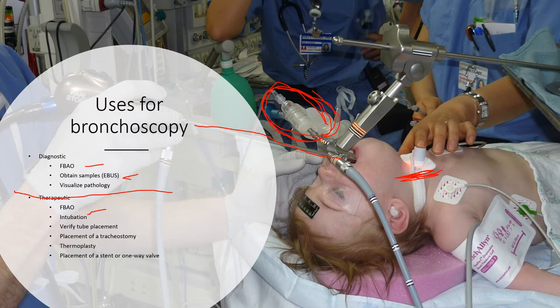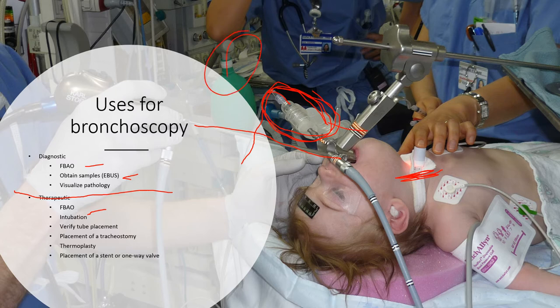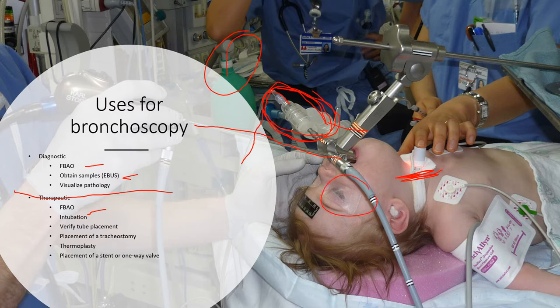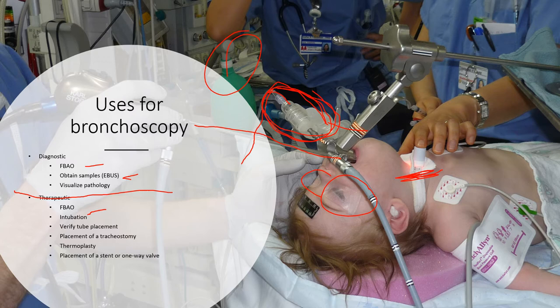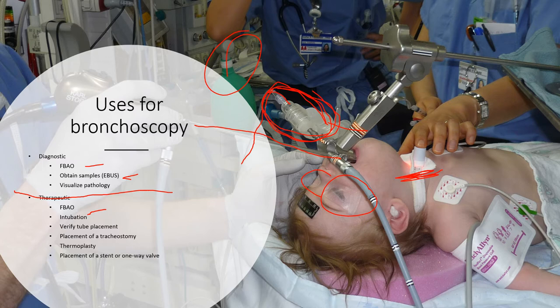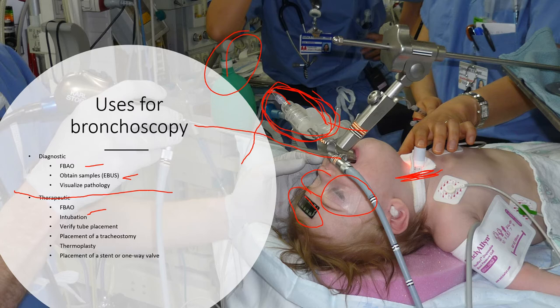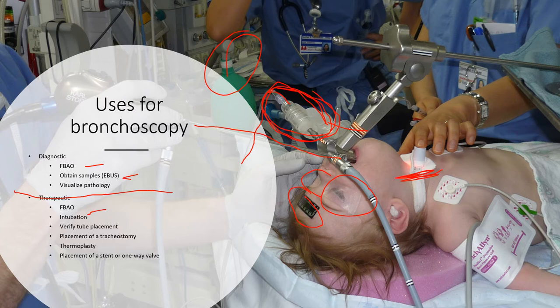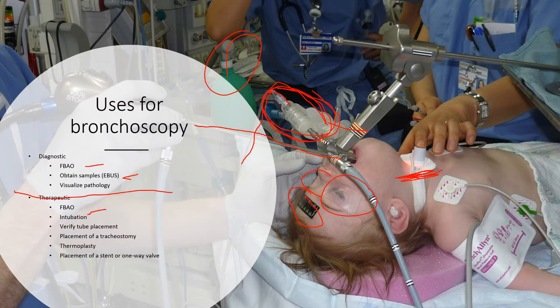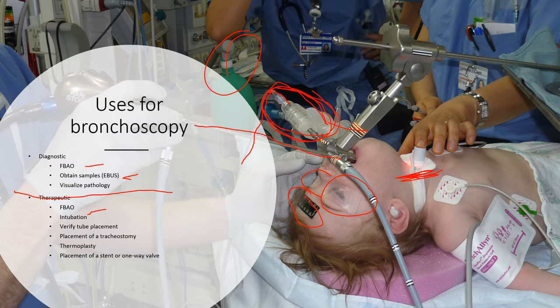You can see the end-tidal CO2 wiring and the circuit going back to the anesthesia machine, so the kid can ventilate during the whole surgery. This kid is paralyzed — the eyes are taped closed to help prevent corneal abrasions. Whenever we chemically paralyze someone, we tape their eyes shut. The device on the kid's forehead is a BIS monitor, which measures their level of consciousness, because a paralyzed patient could still be conscious. The BIS monitor looks at brain waves in a rough way so we can see how well we're doing with sedation on top of paralysis.